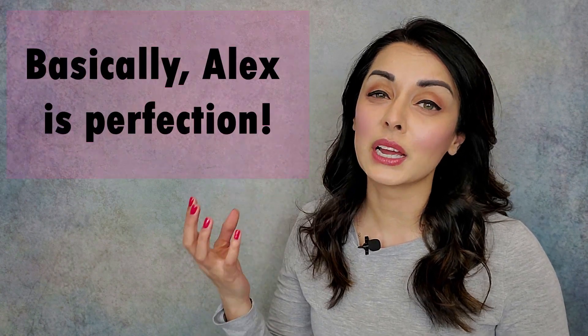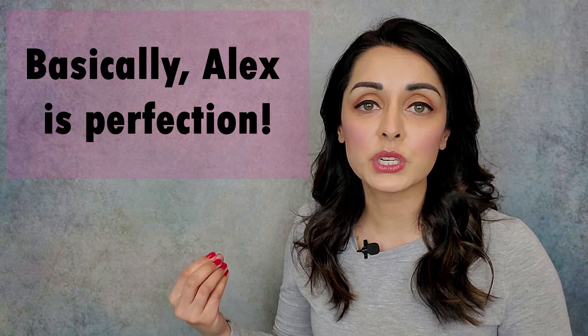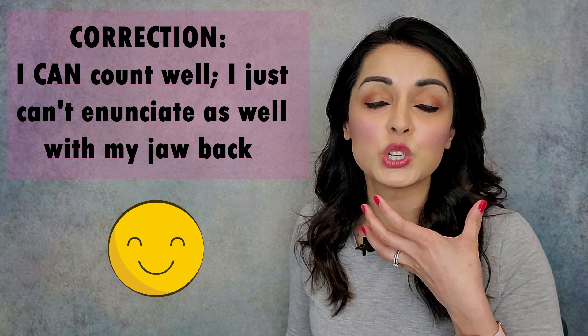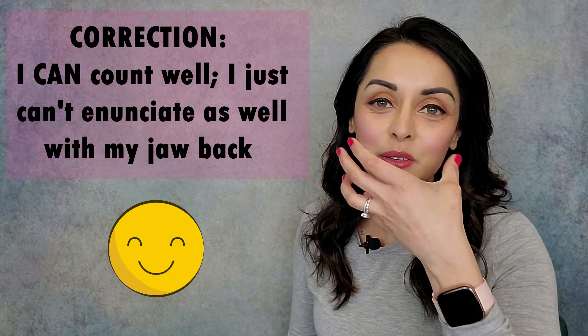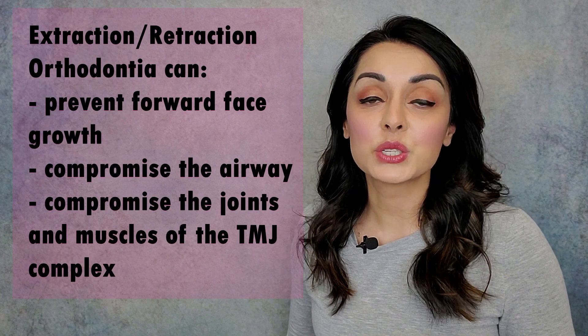A couple of notes: with Alex, we did not see much anterior movement of her jaw when she counted from 66 to 76. She does not have any myofascial concerns, no joint problems, and she has a very ideal occlusion — she's not our typical TMJD patient. When you take this bite on a TMJ patient, you're going to find that a lot of people jut their jaw forward as they count from 66 to 76. Even when I count, you can see my jaw comes forward: 66, 67, 68, 69, 70. I had my four premolars extracted and retraction orthodontia, so I didn't get the forward face growth that probably would have been more ideal for me — that's why my jaw is jutting forwards.